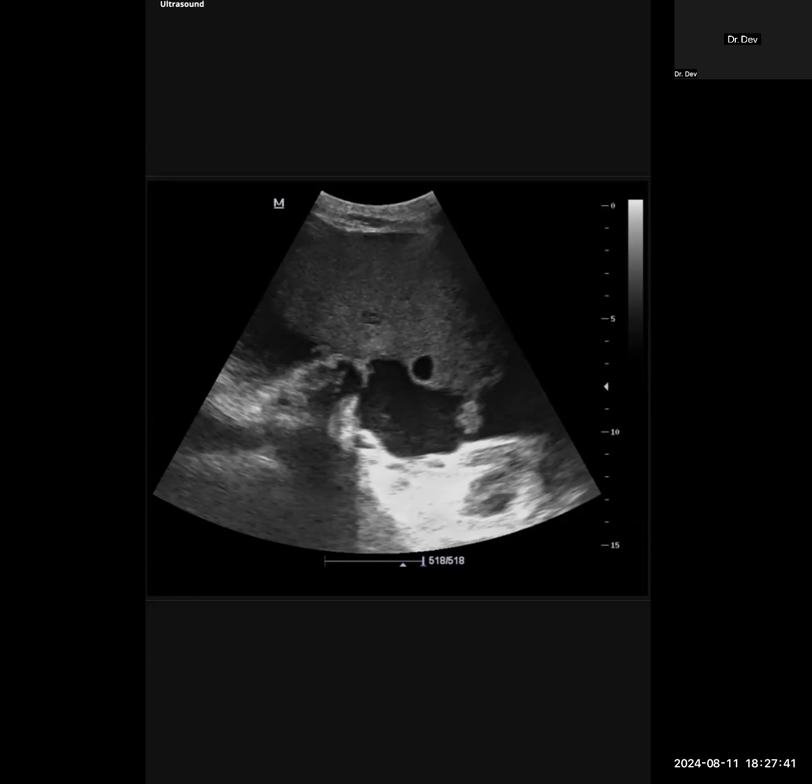When you said deposits and metastasis, what kind of primaries are you thinking about? I'm thinking about gastric malignancies, appendicular mucinous CAs, or any bowel carcinomas that can drop metastasis in the abdomen and pelvis. Which do you think is the most common among the ones that you mentioned? The bowel CA. Okay. Anything else, especially in an elderly woman, that you'd be concerned about? Breast malignancies. Okay, so we'll move on to the next one.